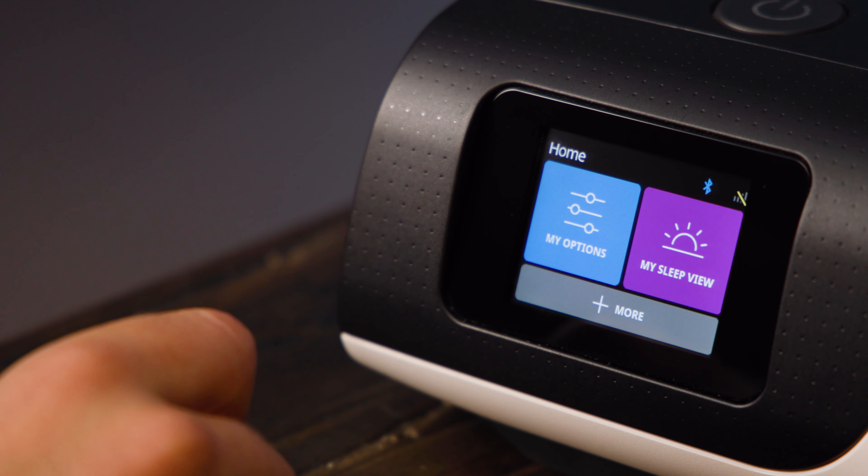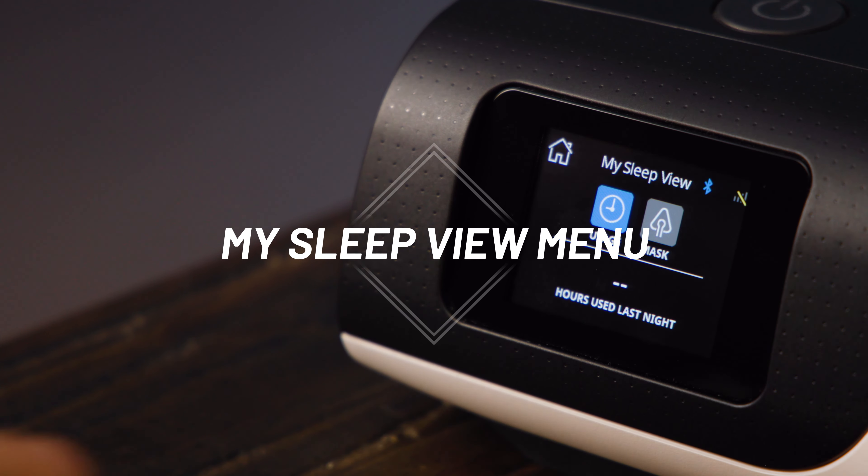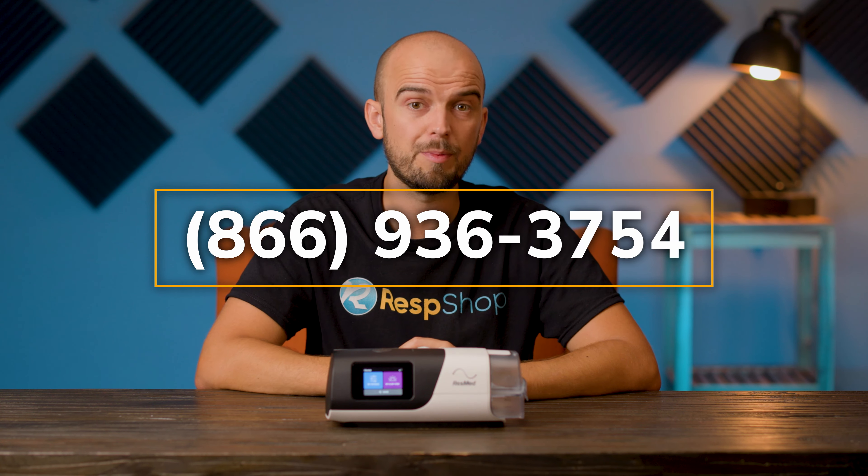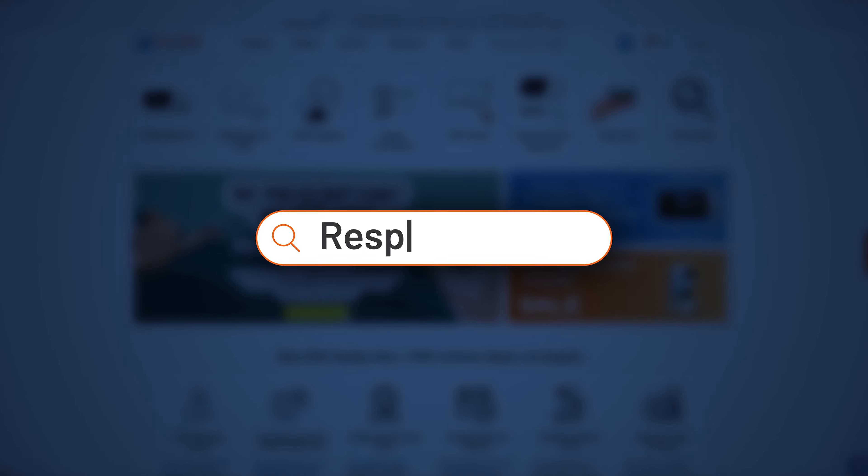Back to the home menu: My Sleep View provides sleep data from your last therapy session. The unit will collect data about your breathing patterns, waking incidents, and time spent using the machine, which is required to monitor the effectiveness of your therapy and for the purposes of compliance, which is required by your insurance company if they're covering the bill. The AirSense 11 can connect to the internet, which means your machine is probably set up to automatically transmit this data to your sleep professional. If it isn't, or if you are not sure about it, get in touch with us at ResPshop, as we provide a remote data downloading service for the AirSense 11.